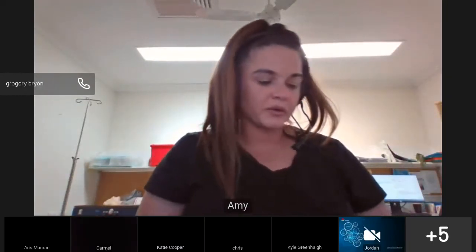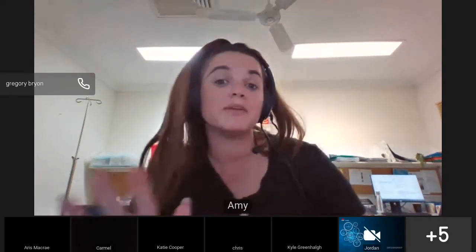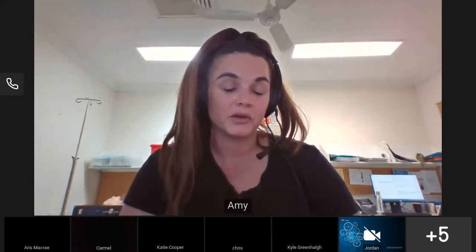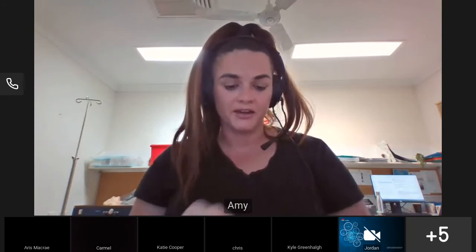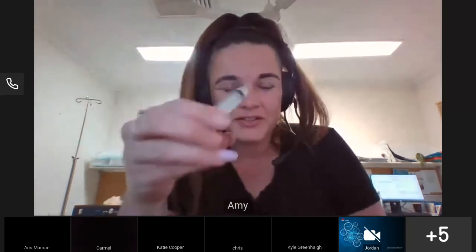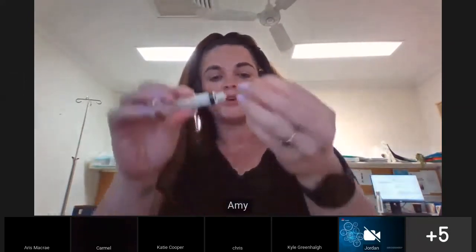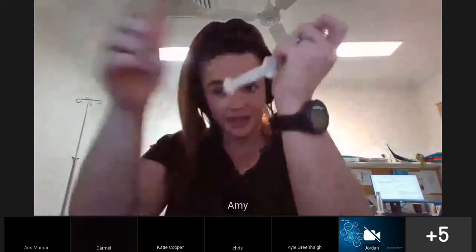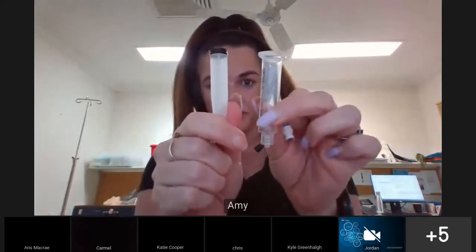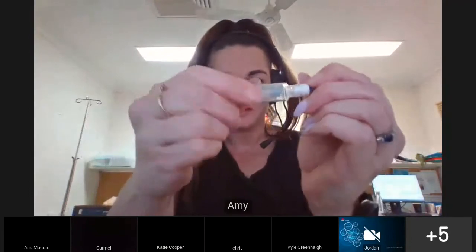The last thing I just wanted to show you, I told you all that I'd show you a little trick if you were concerned that maybe your bung, whatever bung you're using in your LHD, might be causing hemolysis. If you ever want to check that and make sure, just grab a plain syringe, 5-10 mils, something like that. Grab a bung. What I want you to do is just take the plunger out of your plain syringe.